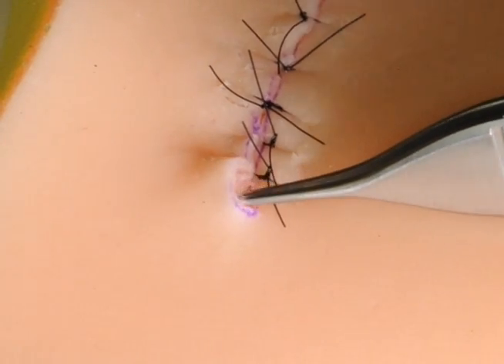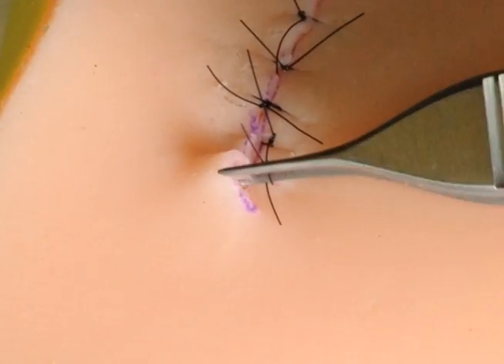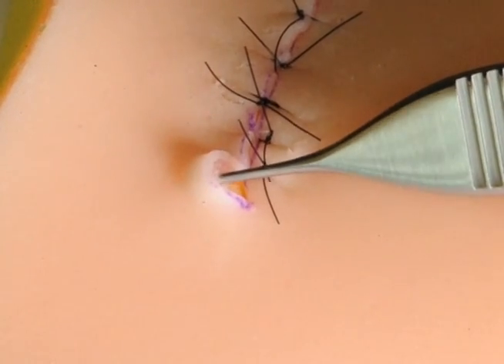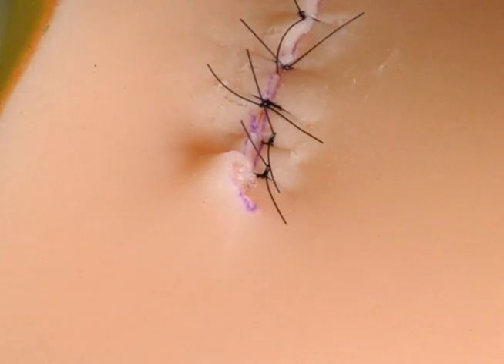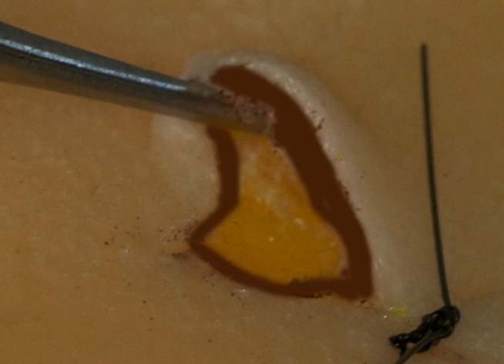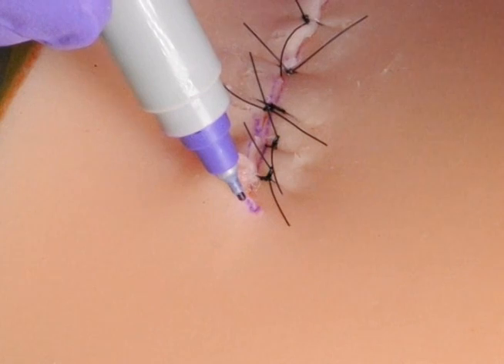The wound repair adjacent to the dog ear illustrated is uneven because of the method used to create the dog ear. In clinical practice, the repaired wound adjacent to the dog ear would lie flat. As you can see from the video, the dog ear is raised above the surrounding tissue and will not lie flat.